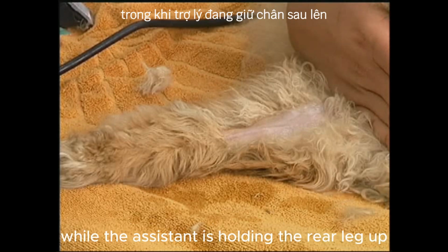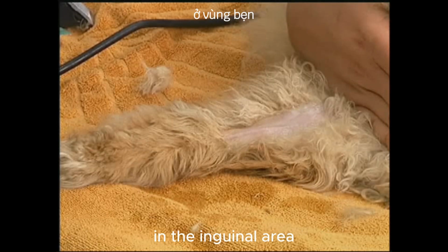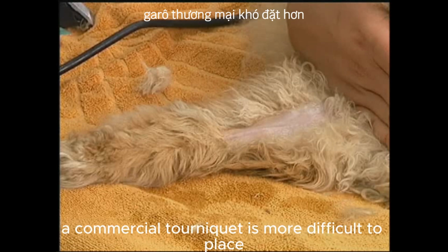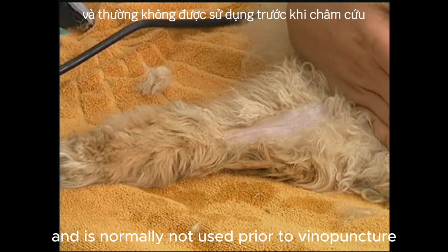While the assistant is holding the rear leg up, they should press down on the bottom leg in the inguinal area to serve as a tourniquet to the femoral vein. A commercial tourniquet is more difficult to place when collecting from the femoral vein and is normally not used.